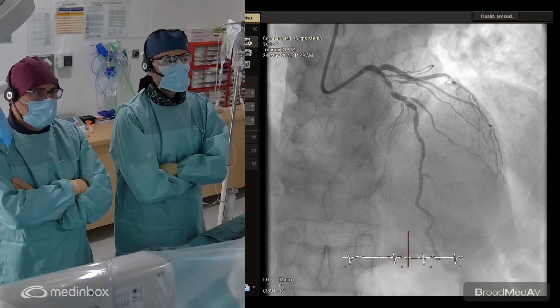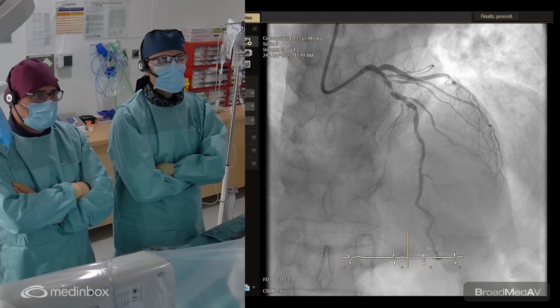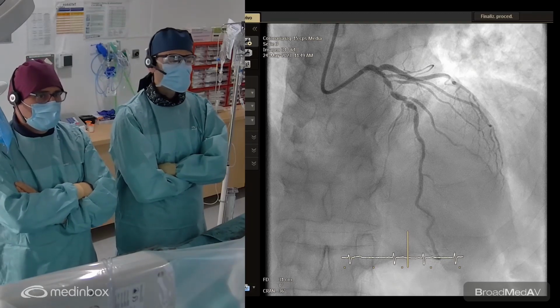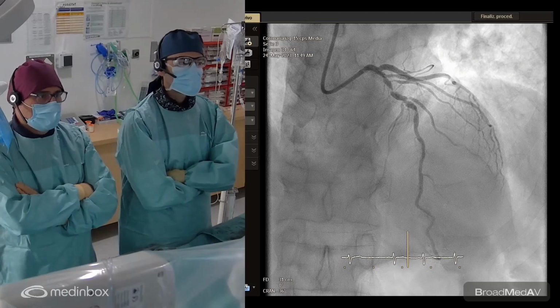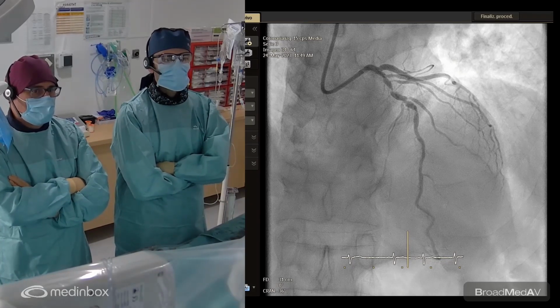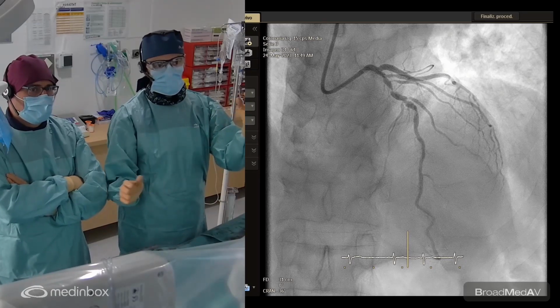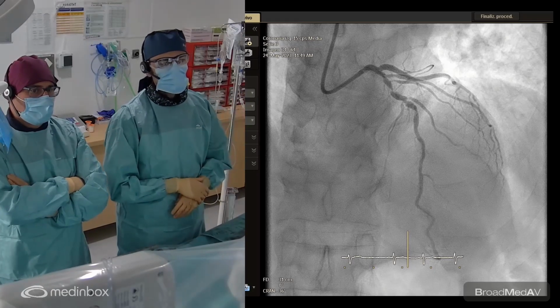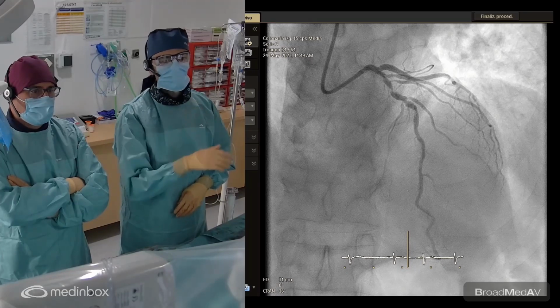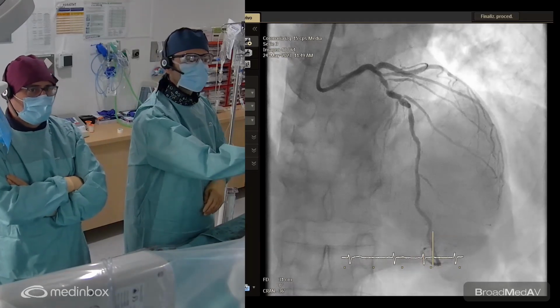You can see probably the bigger one is the proximal, logically. But the disease probably is worse at the ostium of the second and the third diagonal. And also after the more critical stenosis, there is an aneurysm. And we have also been discussing covering all the lesion, including the aneurysm, or using the landing zone, just the proximal part of the aneurysm.